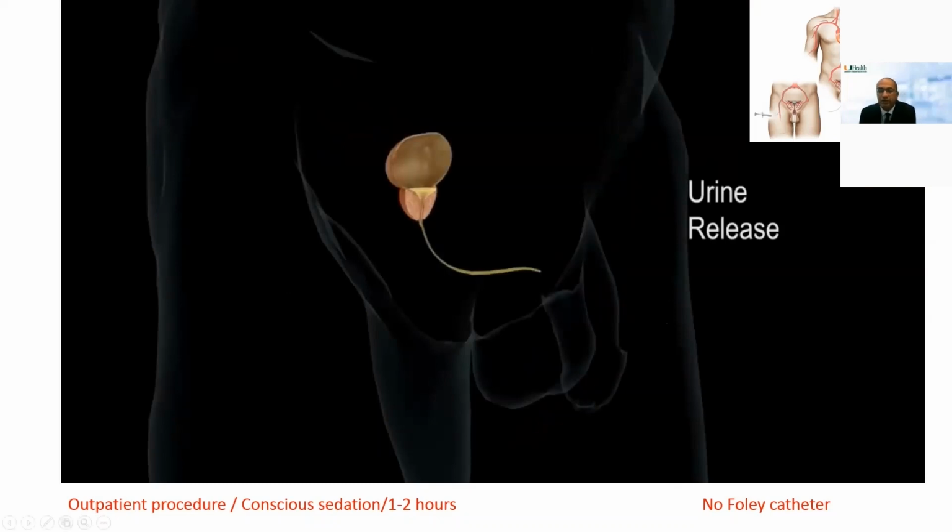in any of our patients unless they have an indication, or they have retention, or they are doing intermittent catheterization. The procedure can be performed via radial access or wrist and groin access, which is standard. But we actually pioneered the radial access for this procedure, and I'm happy to say I've done over like 700 of these through the wrist or radial access.